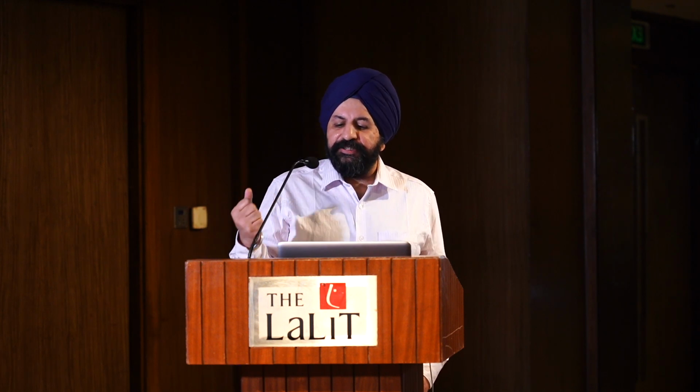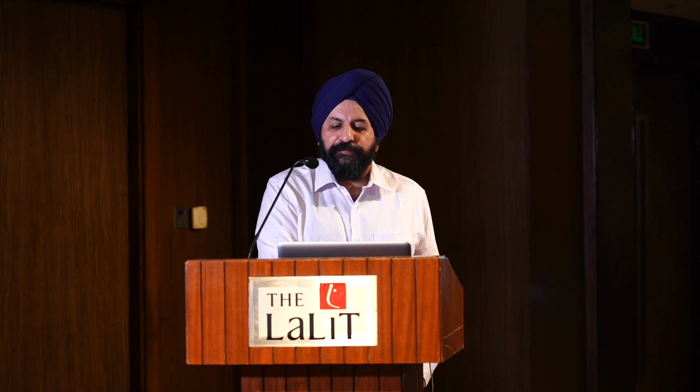So this is one of my cases. So as you can see in the WBC flag, there is this AND symbol. So whenever the analyzer flags an AND symbol, it indicates that the WBC results have been corrected due to the interference of the nucleated RBCs. And as you can look at the bottom, the nucleated RBCs are 46 per 100 WBCs. So whenever there are increased nucleated RBCs, it counts the nucleated RBC as well as auto corrects the WBC.